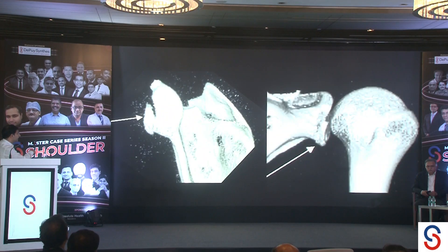We obtained a 3D CT because we were not sure, given the well-centered humeral head, whether the fragment was in position or not. The fragment turns out to be minimally displaced.